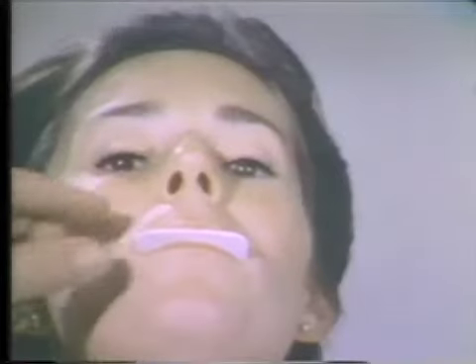The X-ray head is now moved to position in front of the patient. The machine is positioned so that the central beam will pass through the root tips of the lower incisors. From the front, the central ray is aligned along the mid-sagittal plane. With all alignments checked, the exposure is made. The machine is then moved away, the film retrieved, and the patient is ready for dismissal.